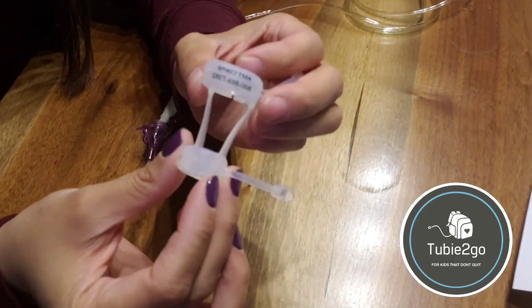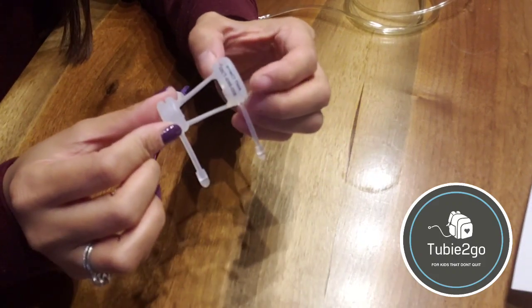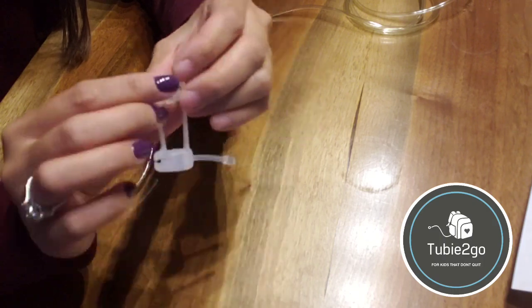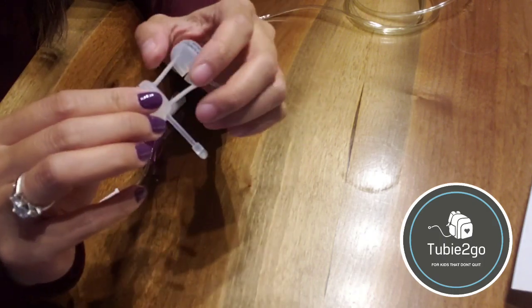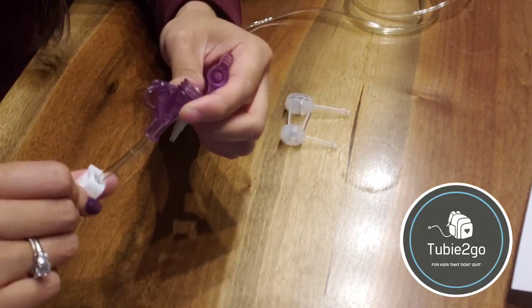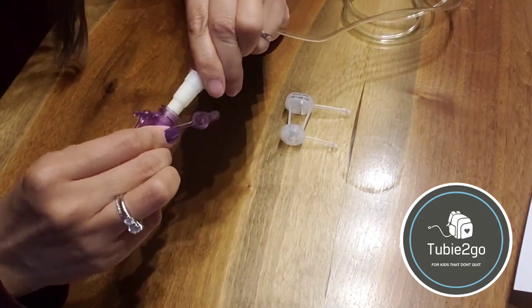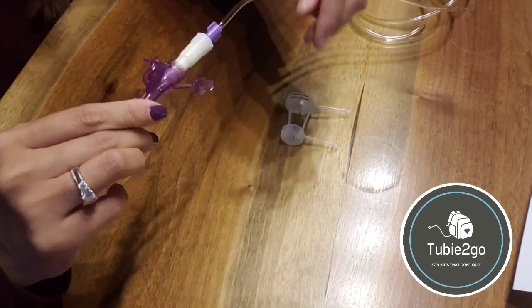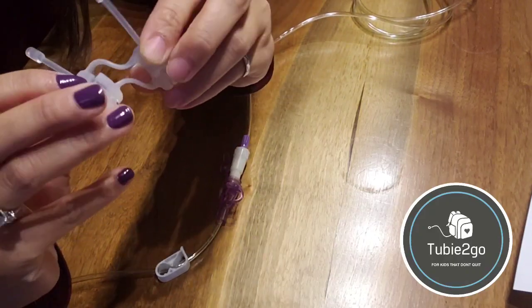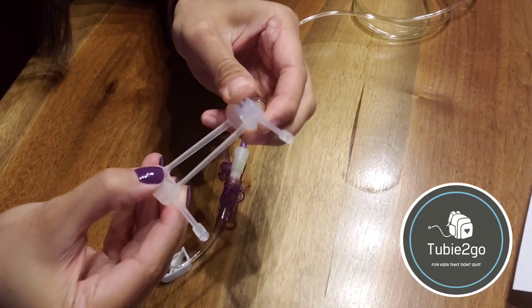This option is called an AMT clamp. It is a securement device that you can source through medical suppliers. Again, manufactured by AMT. The way that it works is you take your feed extension and your feed bag tip, and you put them together as securely as you can. And then you take your clamp, which has two ends that open up. It's just made out of silicone and it's very stretchy.